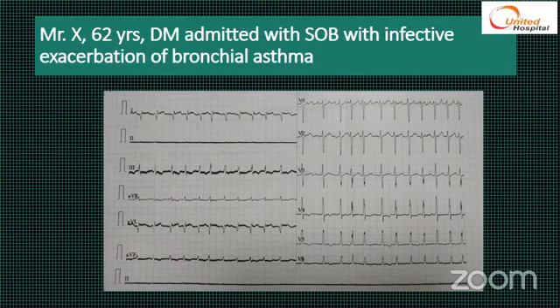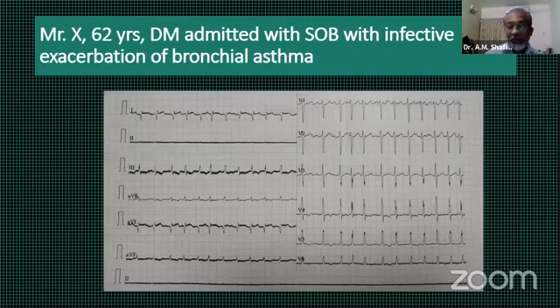Sir, in the AVR, all the waves should be negative in lead AVR, but here I can see the QRS complex is positive there, sir. Okay. I can show the next ECG.